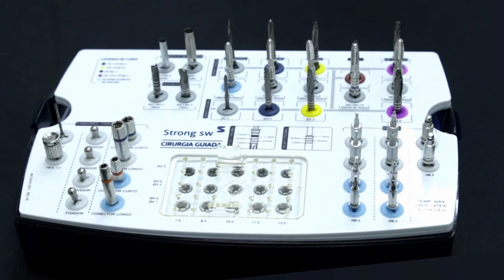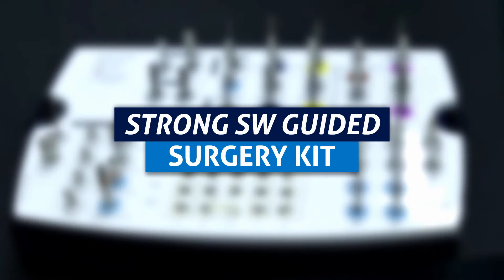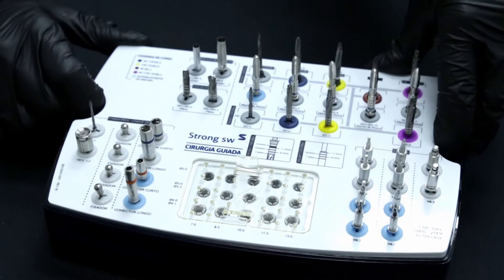Hello! Today we are going to talk about the StrongSW Guided Surgery Kit, exemplifying an implant drilling sequence.